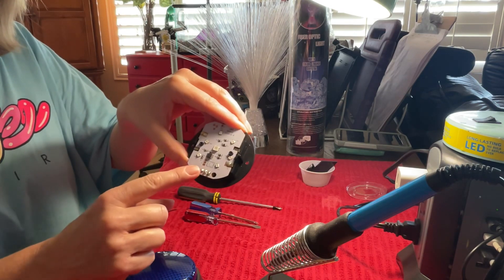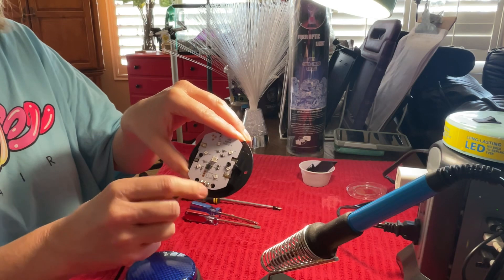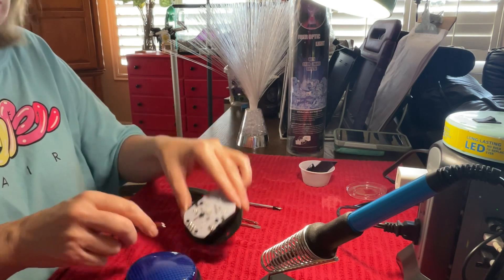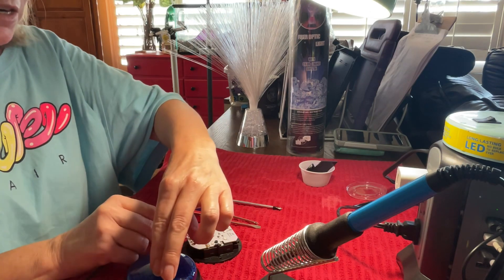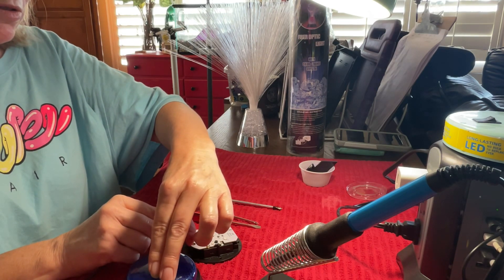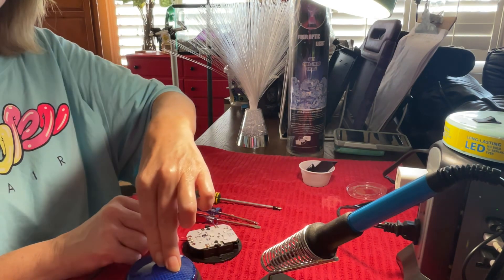There are these two contact points right here. I'm going to put one lead on this side and one on that side, hold it, and use my switch to test to make sure it'll turn on and off. On and off. On — it works.